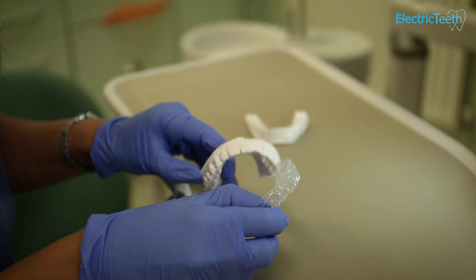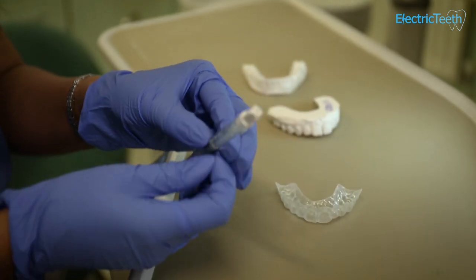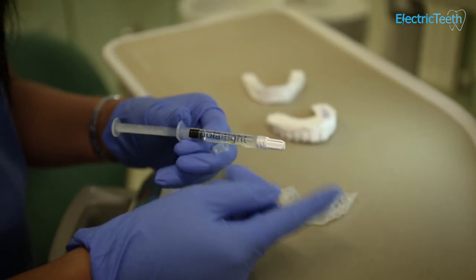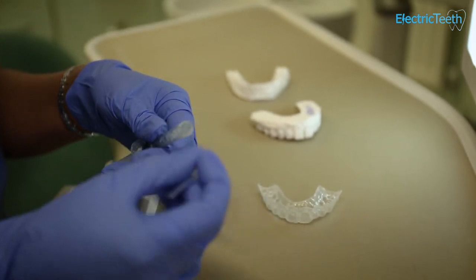The way that you use the whitening trays with the gel is the gel is usually kept cold. This is just an example of the gel — there are many out there, but this for an example is Pola Night. You remove the cap from it and you place the syringe on there.